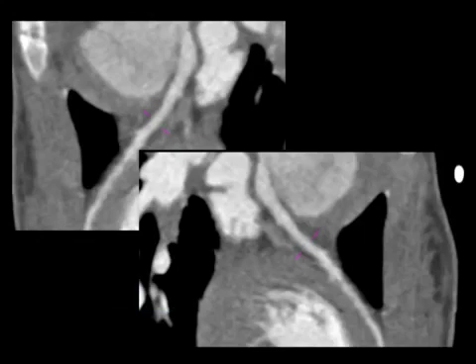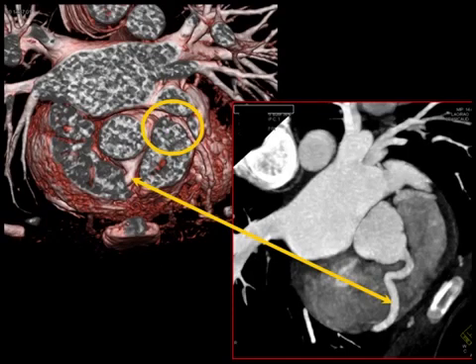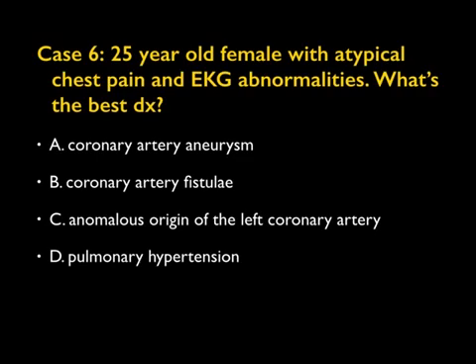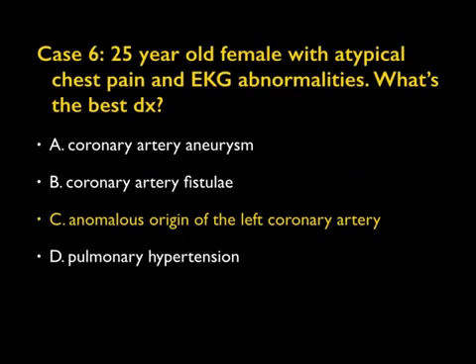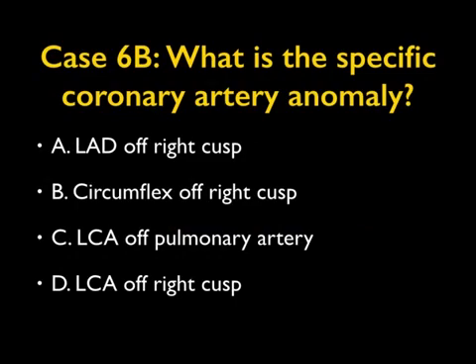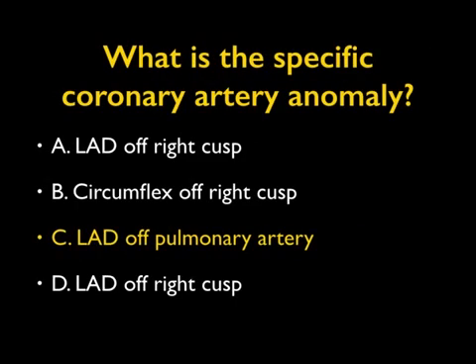Here it is again — you can see it here and in 3D. The question is: what's the best diagnosis? There's a coronary artery, but it's coming off an anomalous origin — not from the cusp of the aorta. The specific answer is that it's the patient's left anterior descending artery coming off the pulmonary artery.